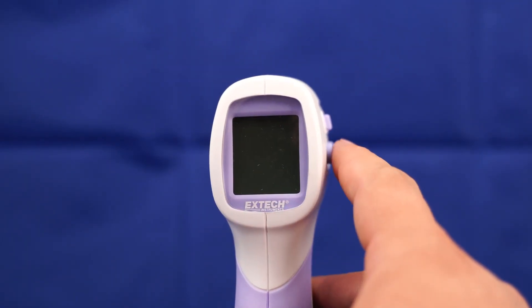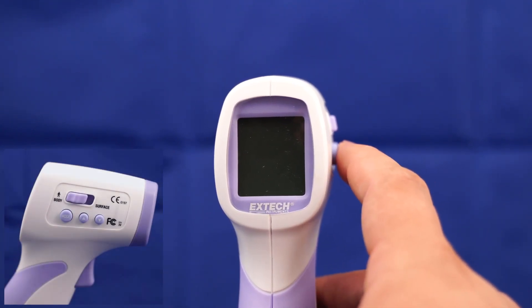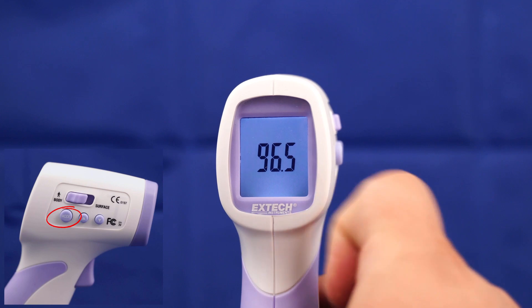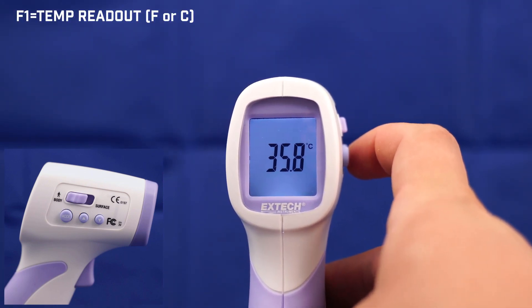From there, we will go into the setup of the XTEC IR200 by holding the mode button down for about a second until we see F1. In F1, we can change from degrees Fahrenheit to degrees Celsius.